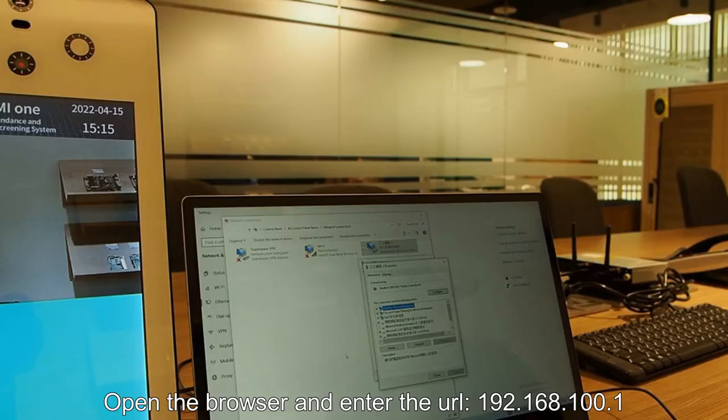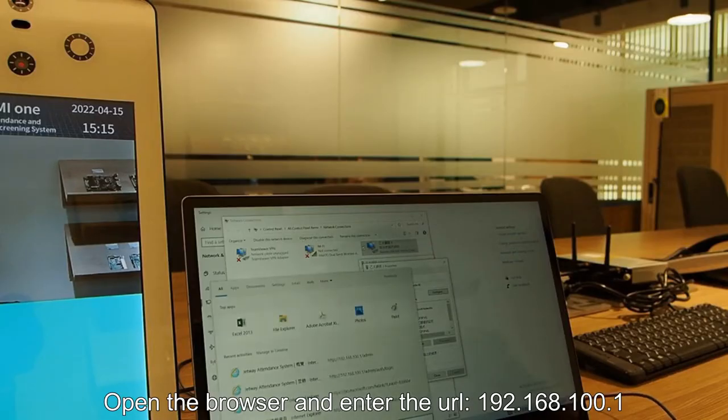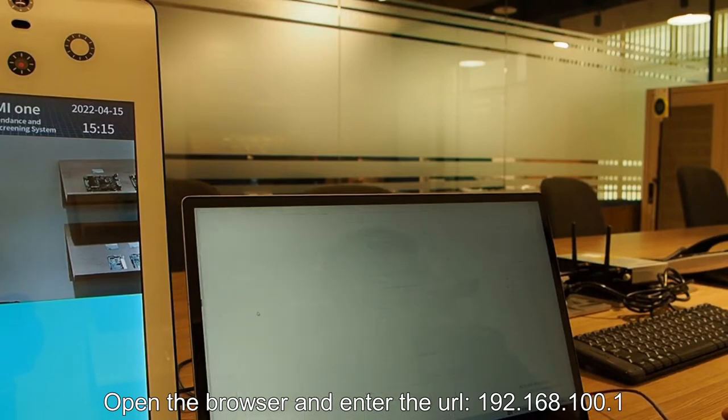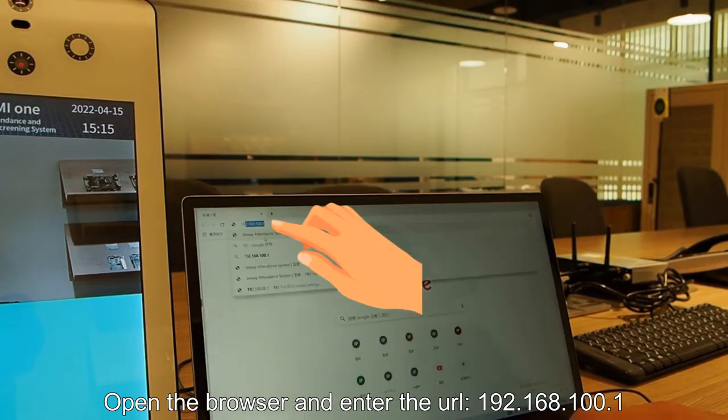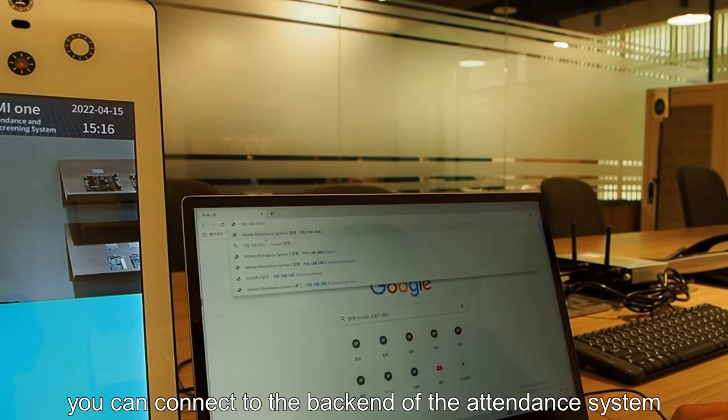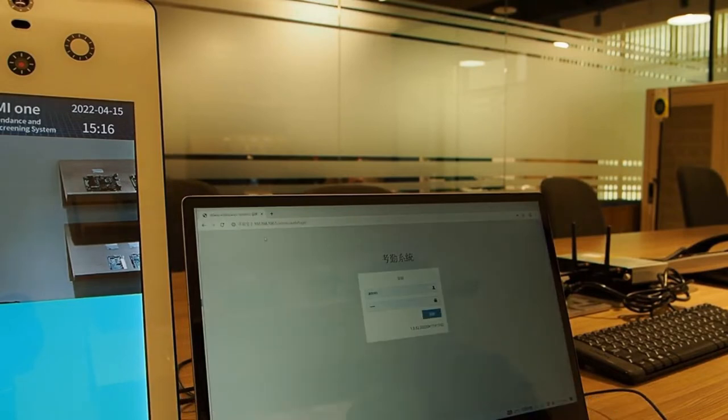Open the browser and enter the URL 192.168.100.1. You can connect to the back end of the attendance system for settings.